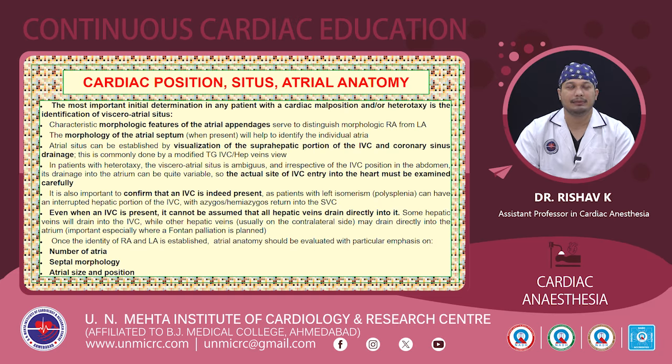Firstly, as I have already mentioned in the previous slides, the characteristic morphologic features of the atrial appendages will serve to distinguish the morphologic right atrium from the left atrium, and the morphology of the atrial septum, when present, will help to identify the individual atria. The atrial situs can be estimated like that from the morphology.